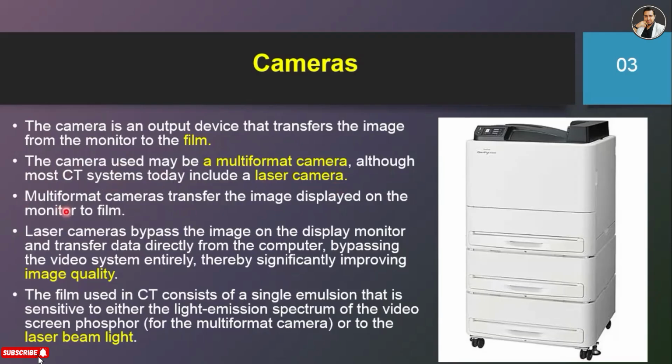The multi-format camera transfers the image displayed on the monitor to film.